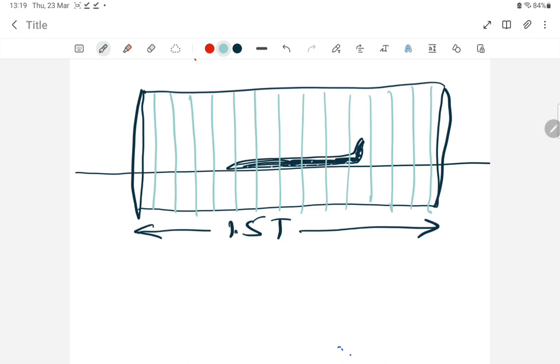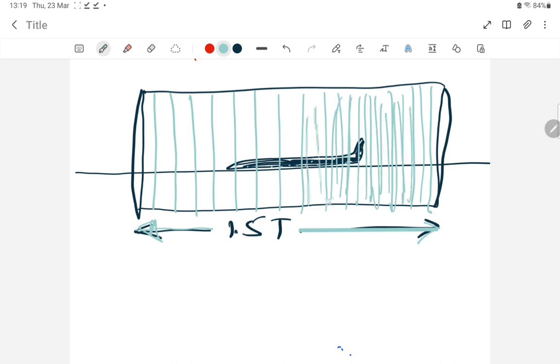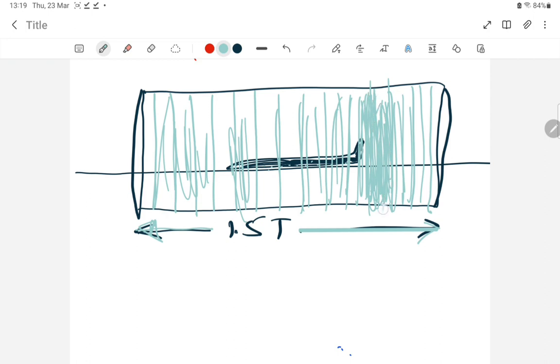If we do some mechanism and disturb this magnetic field somehow, what will happen? Disturb means the magnetic field density is very dense here, sometimes rare, then again dense, then again rare, like this. This field is not homogeneous, you see. Here more field, more density, here more density, and then rare. So you disturb the field. This is non-homogeneous.